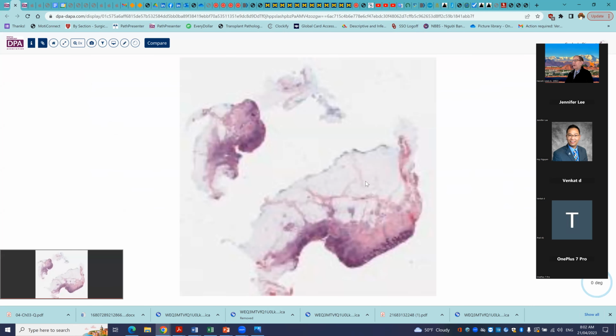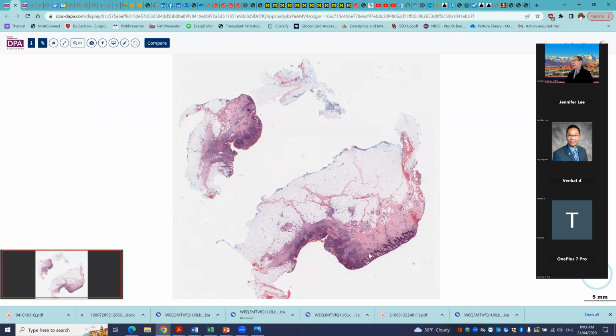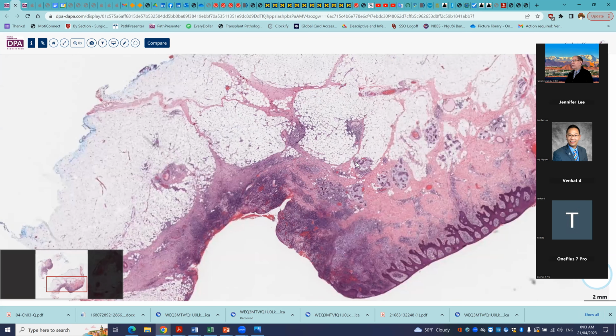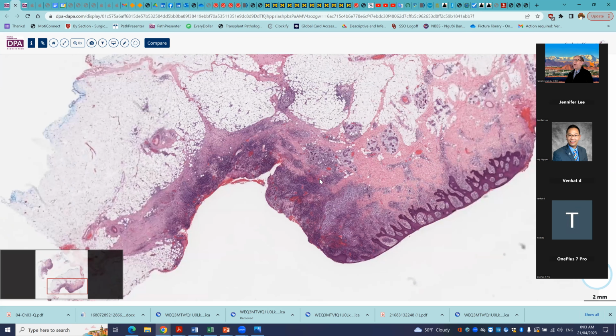They'd had several surgeries for Crohn's disease, and then they gave us the appendix and a portion of the rectum and other cutaneous lesions, which they biopsied. And so this was a lesion from the groin area, quite a distance away from the anal tube.